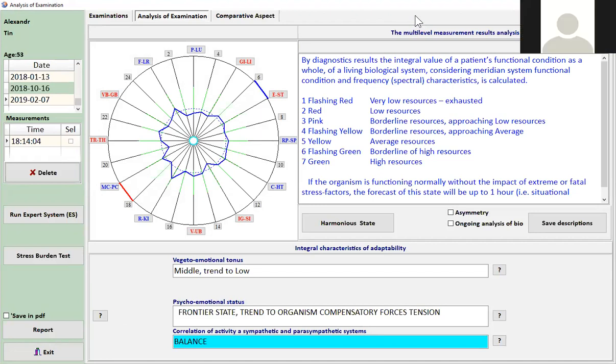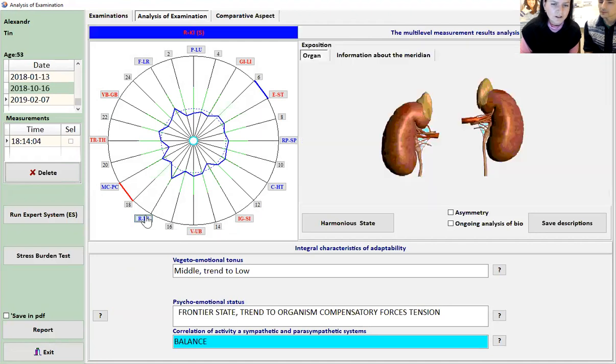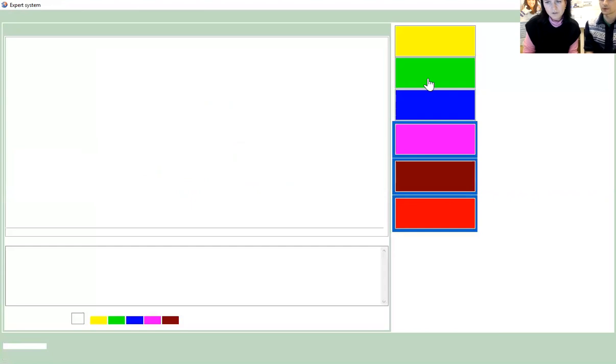Right. So here we got his, also I wanted to explain that when you press on every organ, for example kidneys, you can also see a color here, yeah? So it's the same variation, the colors that you see for too little, too much, or over this. I'll show you. This one. So these colors.